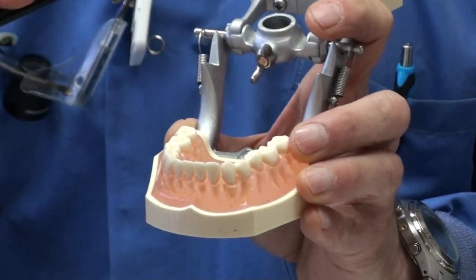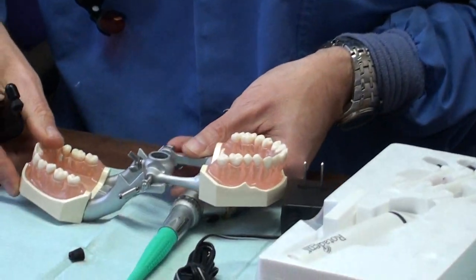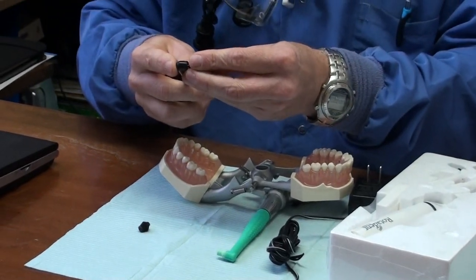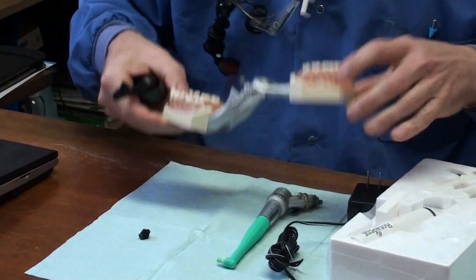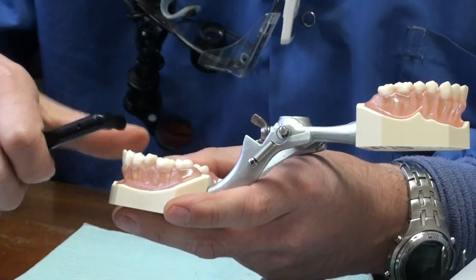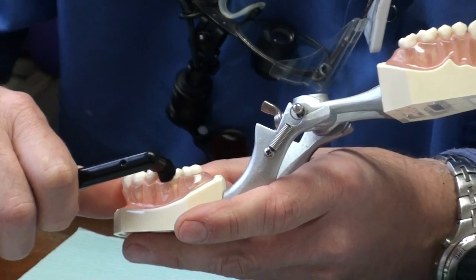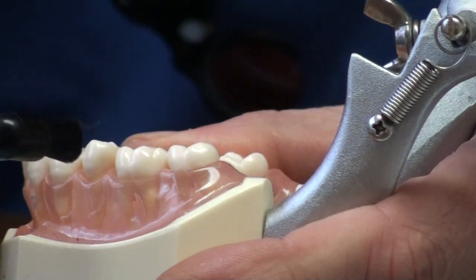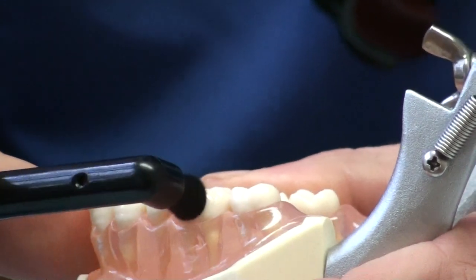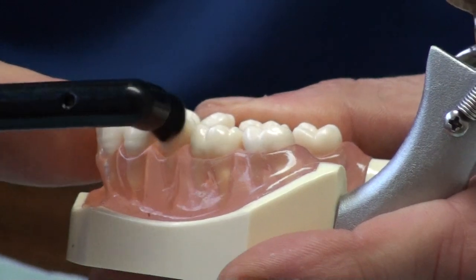For the pointed brush, for getting in between the teeth, there is also a flat brush. We'll change the brush — and it works the same way. Place it right at the tooth, right where the tooth meets the gum, and you just rotate it front and back. And you can go all the way around the mouth.